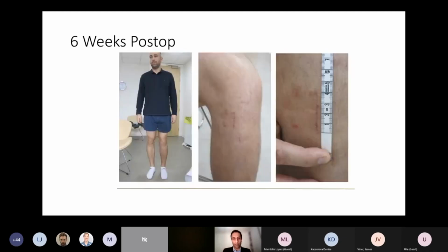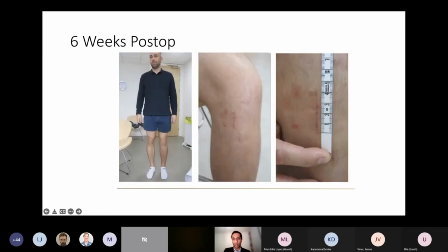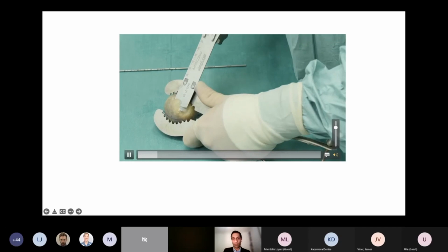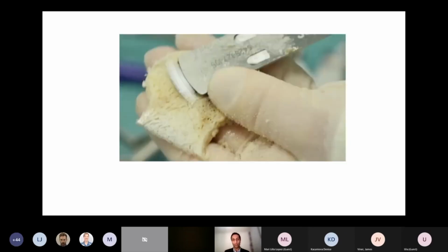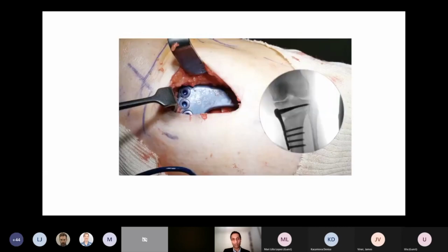So what's changed recently? Well, once again, it's not just about showing off that we're able to do small incisions. We know that small incision surgery is associated with less pain. So it's definitely doable. But in the past, these incisions used to be three or four times the size. And so it does really help with their pain management. Here's another recent advance that I mentioned earlier, that we use this bone wedge. Having done preoperative planning, knowing exactly how much we're going to open the osteotomy gap, we fashion a bone wedge, and we call this a precision bone wedge because we make it exactly the right size for the osteotomy opening, and we can fix that in place.